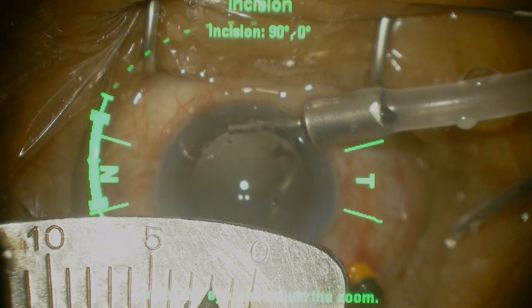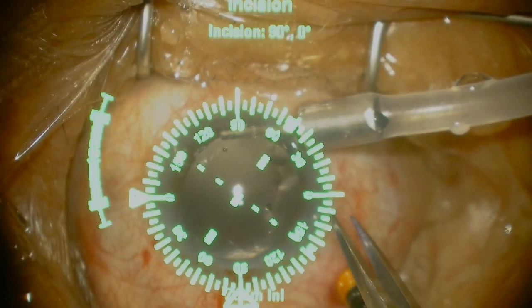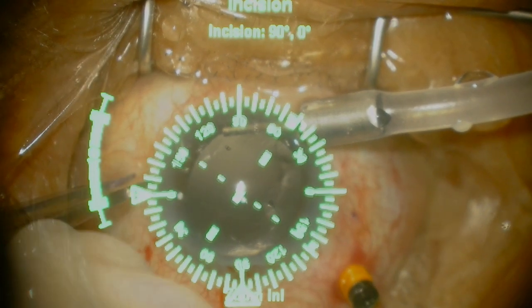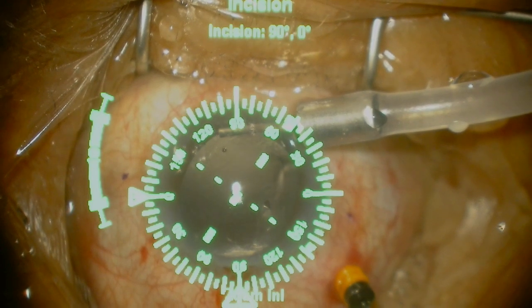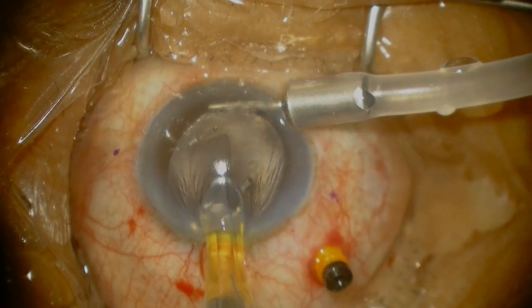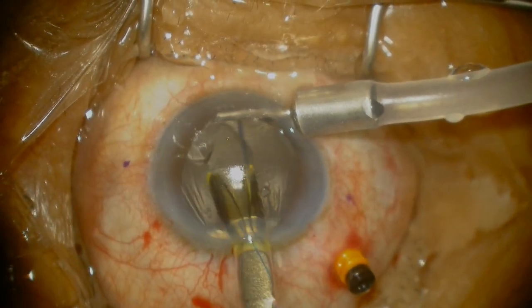Marking and entry points are very important. I tend to go 2mm posterior to the limbus. I have the benefit of using a Verion image-guided system which allows me to mark exactly 180 degrees apart. There are many markers available — you can do it manually with a Mendez marker or something very nicely designed by Ashwin Agarwal. The Ashwin Agarwal marker does that well as well.